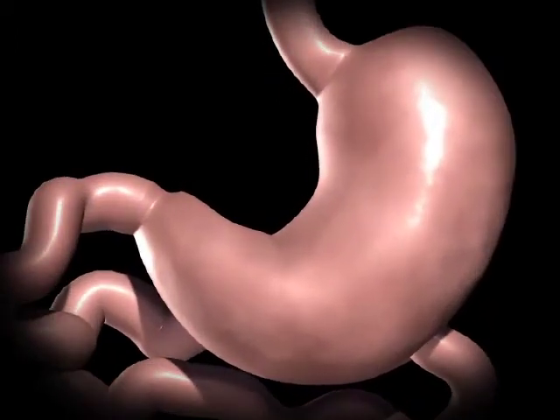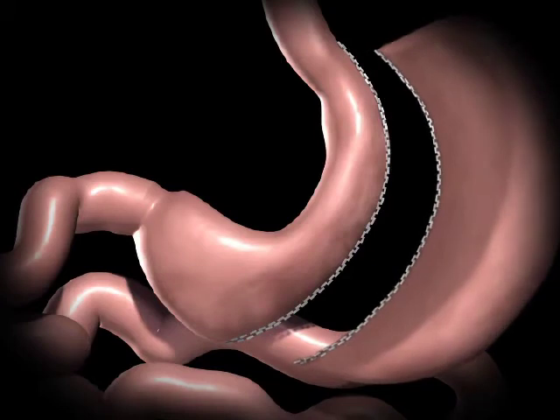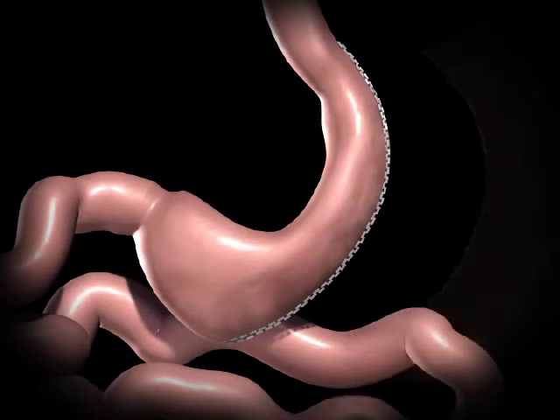During a sleeve gastrectomy, a thin vertical sleeve is created by using a stapling device. The excised portion of the stomach is removed.